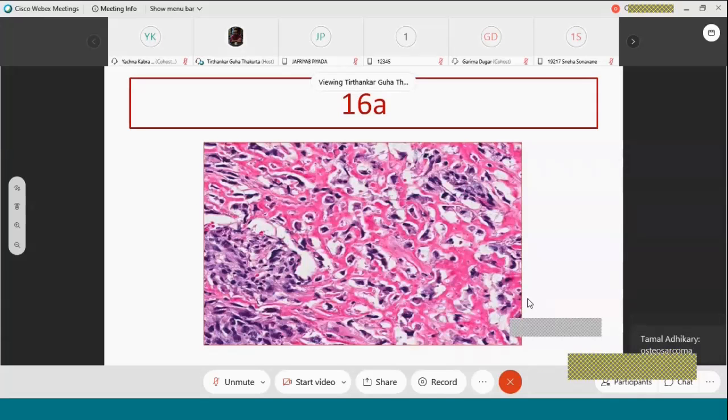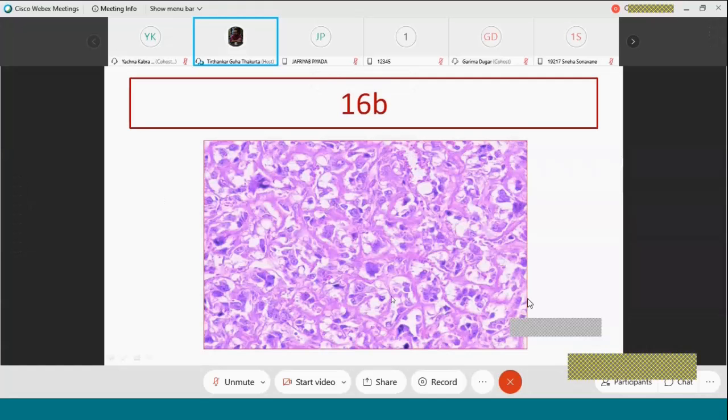This typically is the appearance, this lace-like, fungal hyphae-like, dark pink appearance, is the appearance of the developing bone tissue called osteoid. And the dark cells are malignant cells. So, an interlacing osteoid matrix with intervening hyperchromatic cells is classical of osteosarcoma. This is the primary bone tumor osteosarcoma, also called osteogenic sarcoma. This is another picture showing the lace-like structure of the osteoid matrix, in between which there are violet colored cells.